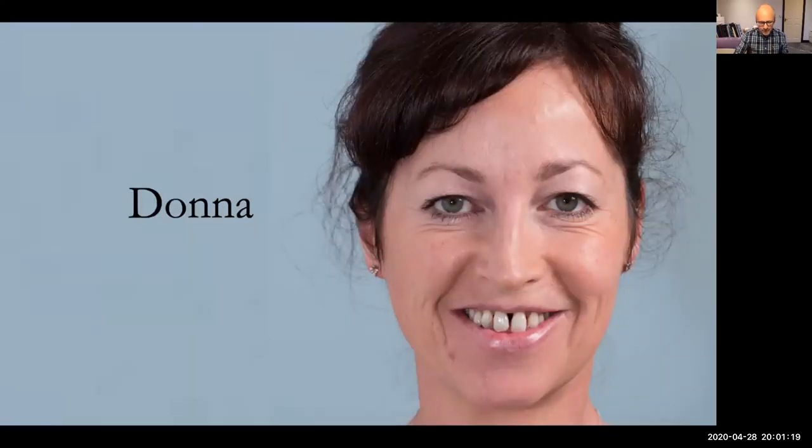This is Donna. Now, some of you may have seen this patient before and what I actually did for her. However, I've included the actual process of taking the impressions for Donna in this for this evening, specifically because this is about immediate dentures. So Donna presented to me a few years ago. She was in her mid-40s and ever so embarrassed about her teeth. She did not like being out in public and was really quite introvert socially because of her teeth. They'd started to drift, periodontally drift.